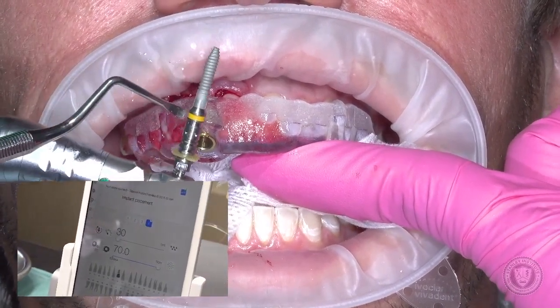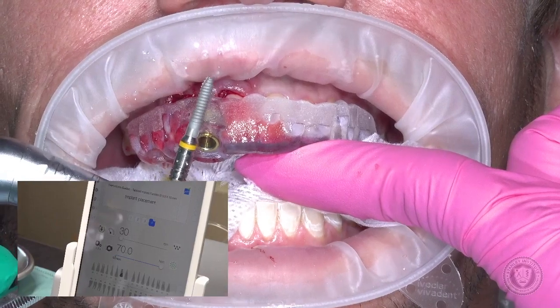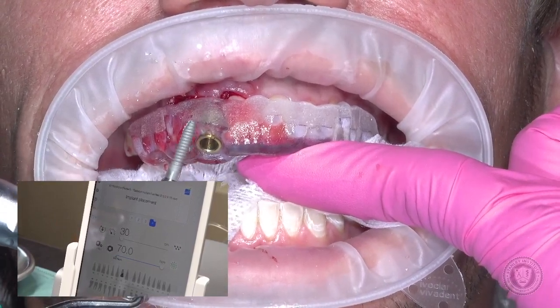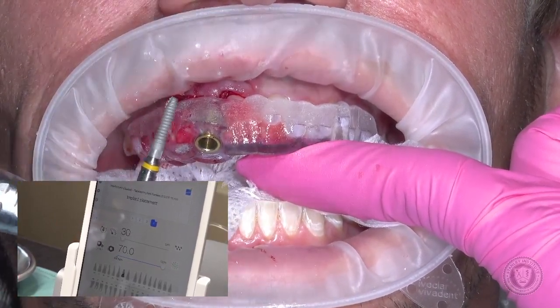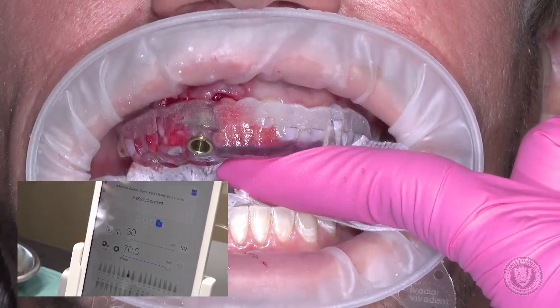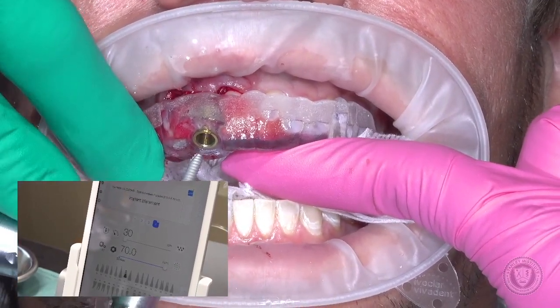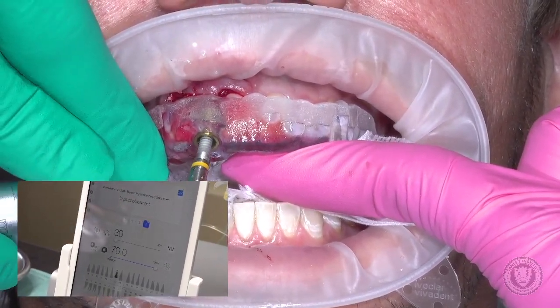Here's my implant — color-coded. This is yellow because this is my stop-link. When I touch this to the top of the guide, that's how I know that I'm down deep enough. We're going to confirm that the speed has changed and the water's off. My assistant Sarah has already asked me and I've confirmed it. So this goes into the hole.